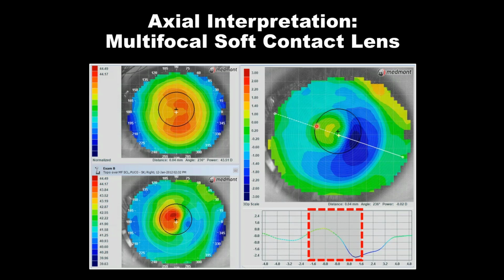So for this patient, if aberrations are a problem and we're not really picking up more multifocality, I understand what might be at work: the optics of the lens, the center of the lens axis and the visual axis are around a millimeter, maybe 0.8 millimeters separated. So we're not really centering this contact lens as we should.